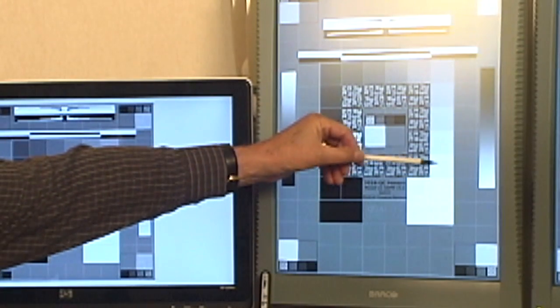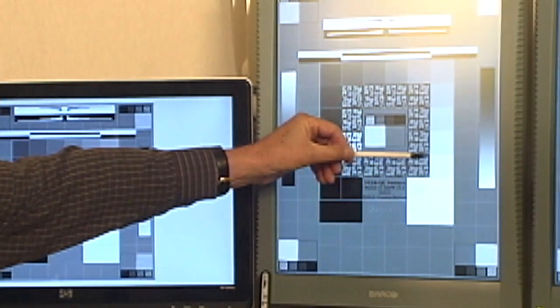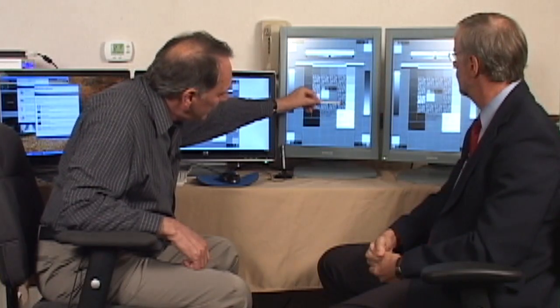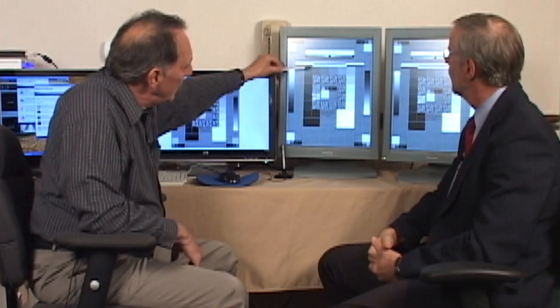But there's a square down there that is actually 4 digital driving levels lower than the square's value. And opposite corners are the same. And then your opposite corners here are +4 digital driving levels. So that's roughly 8 just noticeable differences. And these should be visible in each individual block. Yes. So each block will be in the corners, a little square. Those squares all the way around.